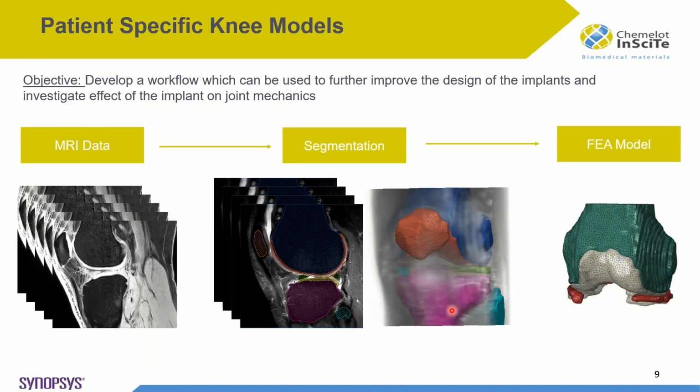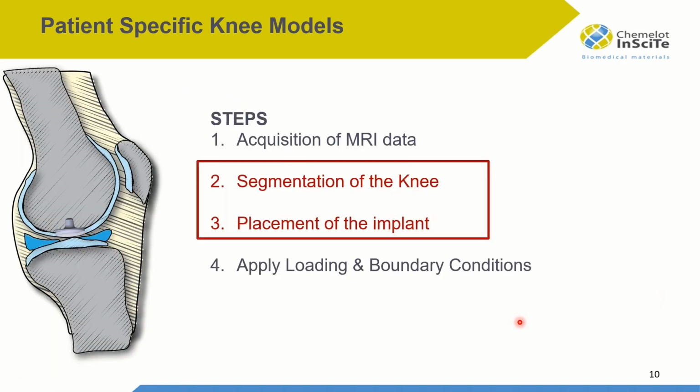Now we can come to the point on how we use the Synopsys software in our work. Currently in the project, we are in a stage where we need to develop knee models in order to see if the implant is positioned correctly, is carrying enough load, or during walking or other activities, the implant is not overloaded.